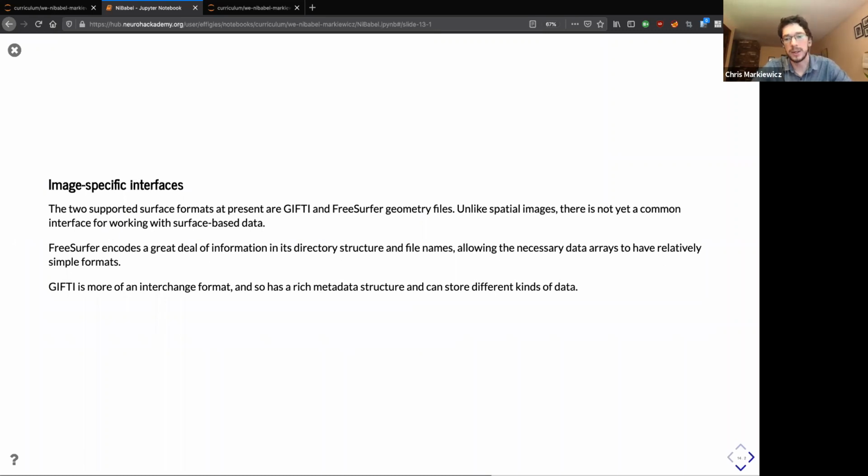Okay, what's the difference between a vertex and a voxel? A vertex is a point in space. A voxel is a point in space that has spatial extent, a 3D spatial extent. And the useful thing about voxels is if you look in any direction from them in the data array, you find something that's close to you. That's not necessarily true in vertices. There's no good way to tile a triangular mesh such that the closer 2 points are in space, the closer they are in the data matrix. There's just no way to do that that will be true for the entire space.